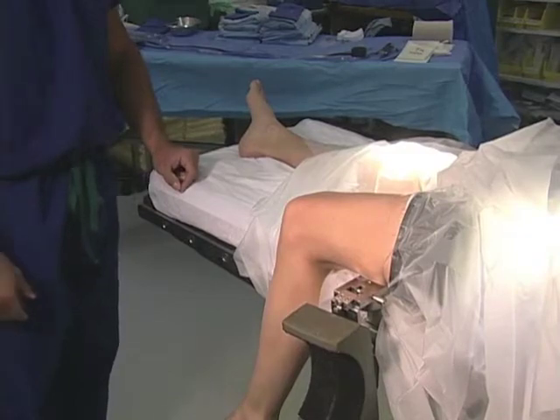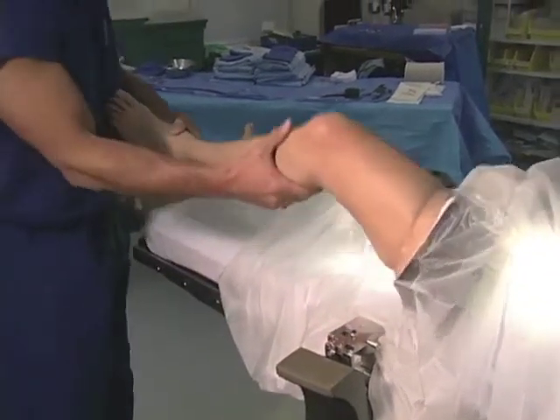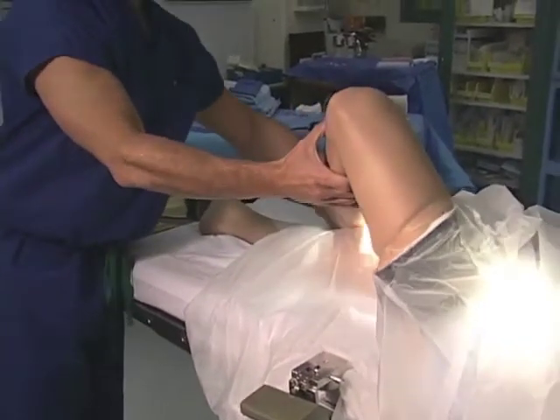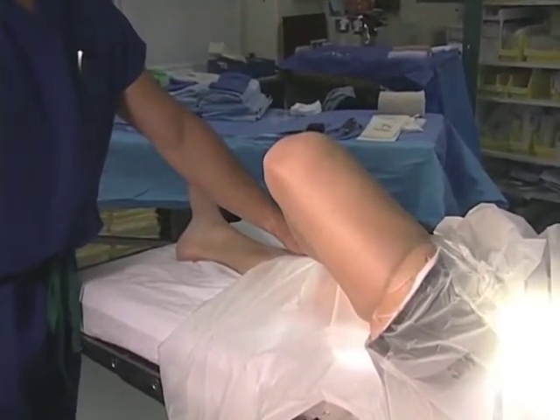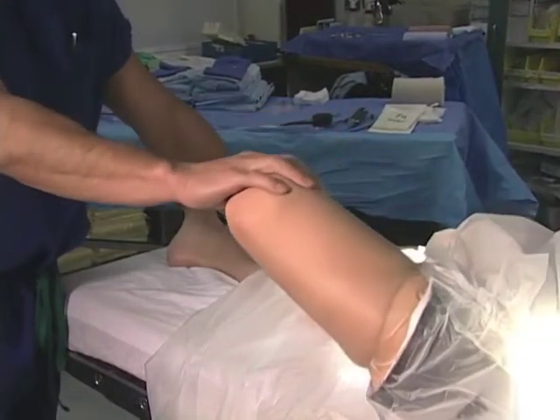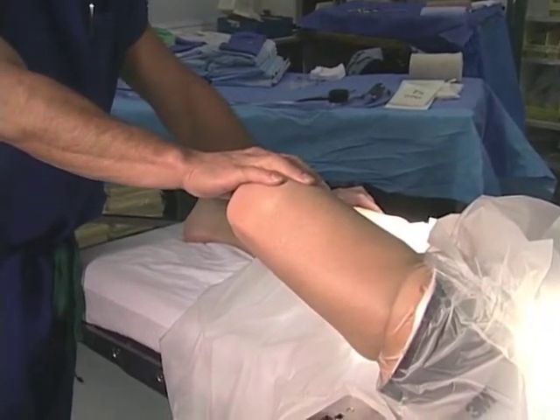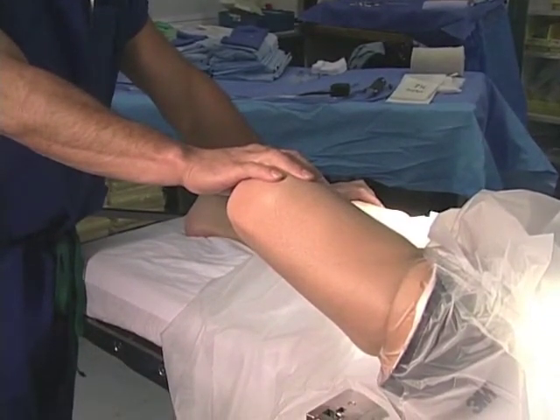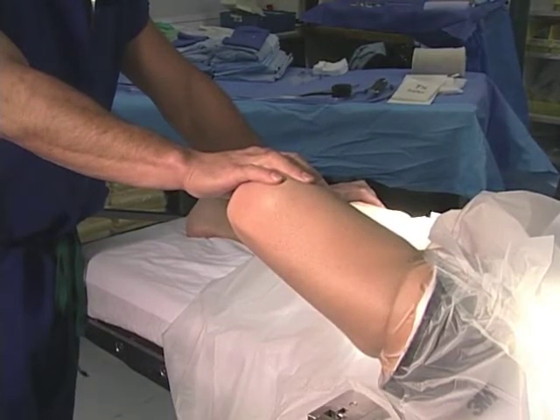This allows arthroscopy of the intercondylar notch. The surgeon takes the ankle and rests it across the contralateral leg with the knee bent to 90 degrees and sometimes applies pressure on the knee. Pushing the knee to the floor allows the hip to externally rotate, which imparts a varus force, allowing for lateral compartment opening and arthroscopy.